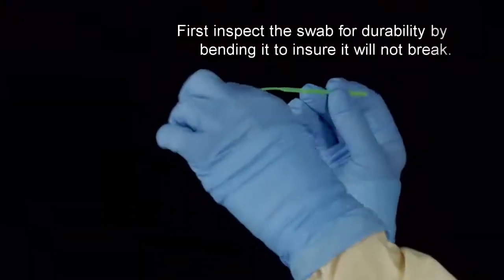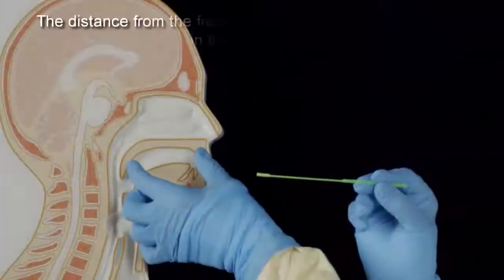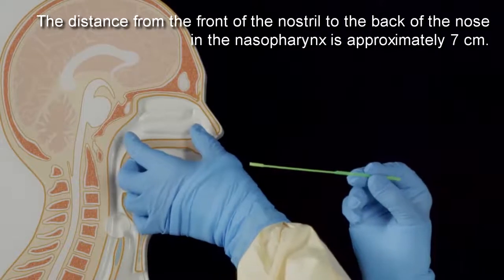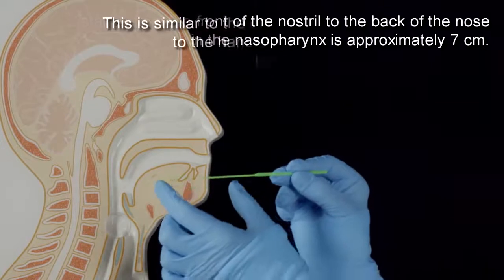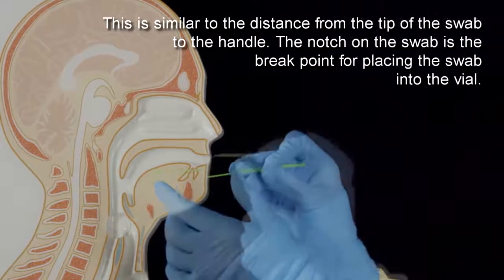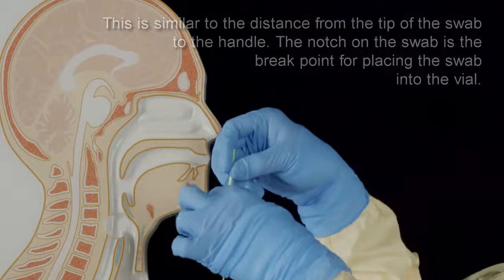First, inspect the swab for durability by bending it to ensure it will not break. The distance from the front of the nostril to the back of the nose and the nasopharynx is approximately 7 centimeters. This is similar to the distance from the tip of the swab to the handle. The notch on the swab is the break point for placing the swab into the vial.